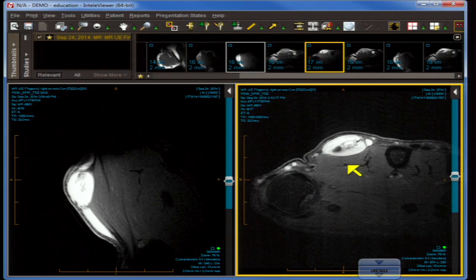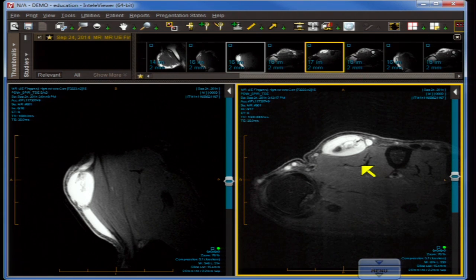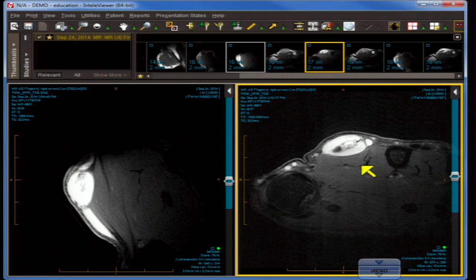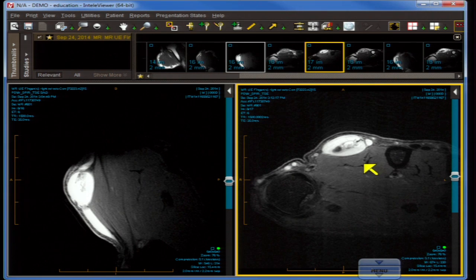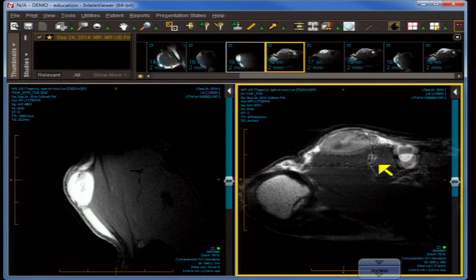The zone of transition is very sharp with little evidence of surrounding edema. So far, all features we've identified suggest non-aggressive behavior — particularly the finding that the mass does not cross compartmental boundaries; for instance, it doesn't go from the subcutis into the muscle. Let's take a look at the T1 weighted image.